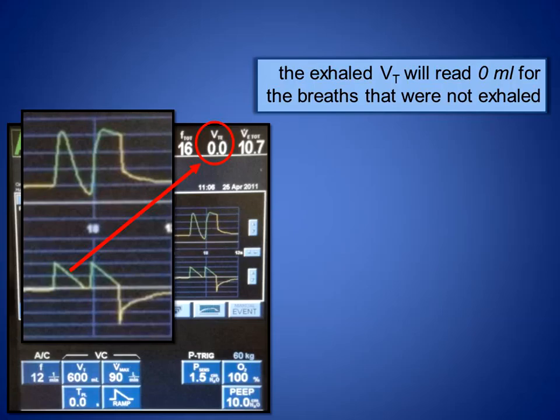I'm going to point out on the scalar graphics how you can recognize this here. I've blown up this particular 1 breath here, and you can see that there is an inspiratory flow delivered to the patient, and then followed right afterwards there's a second inspiratory flow. So I'm looking at the flow time scalar, and you have this M here, and you also have the same thing up on your pressure time scalar. So thinking about the logistics that we just described, that is what's occurring there.